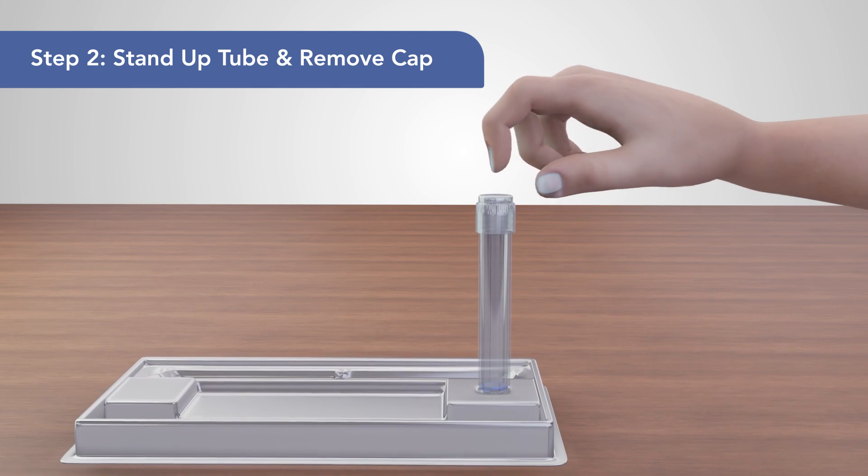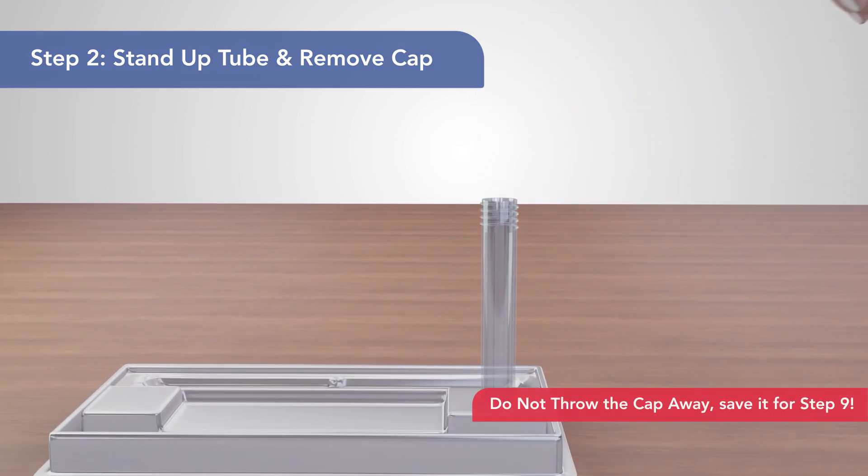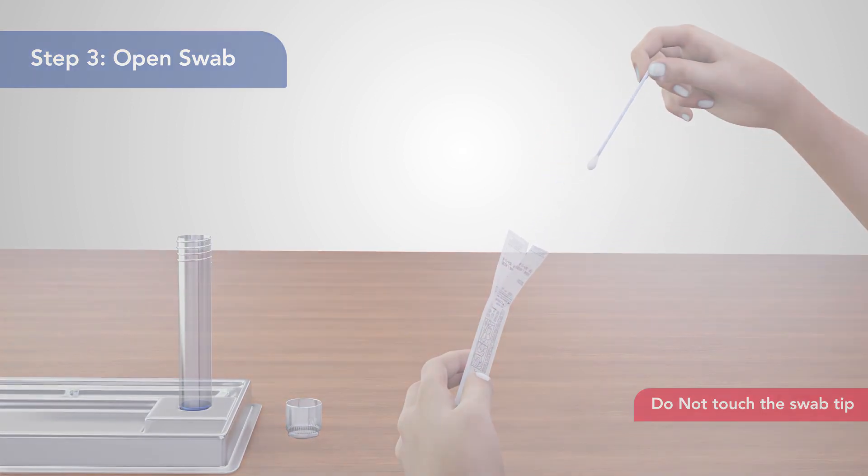2. Place the tube upright in the tube holder included in your test kit tray and remove the cap. 3. Remove the swab from its packaging from its stick end.